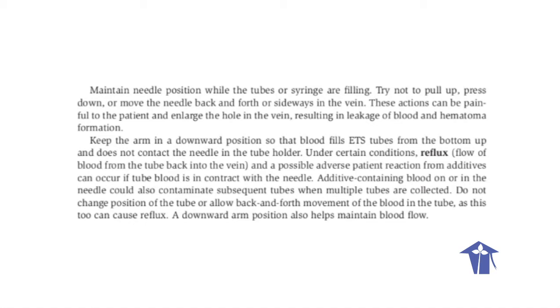Try not to pull up, press down, or move the needle back and forth or sideways in the vein. These actions may be painful to the patient and enlarge the hole in the vein, resulting in leakage of blood and hematoma formation. Keep the arm in a downward position so that the blood fills ETS tubes from the bottom up and does not contact the needle in the tube holder.